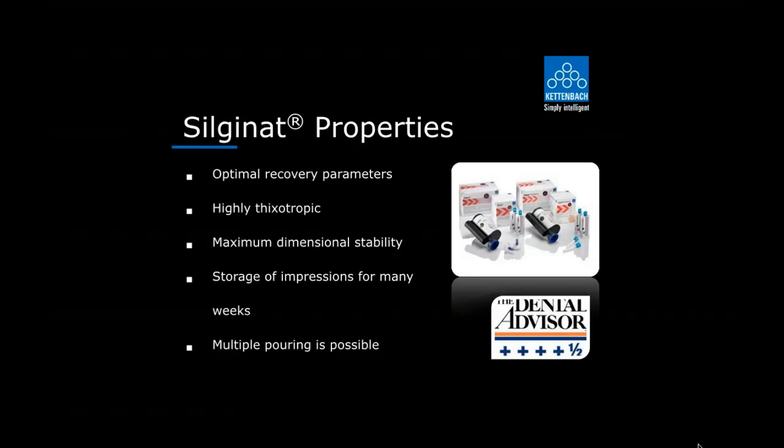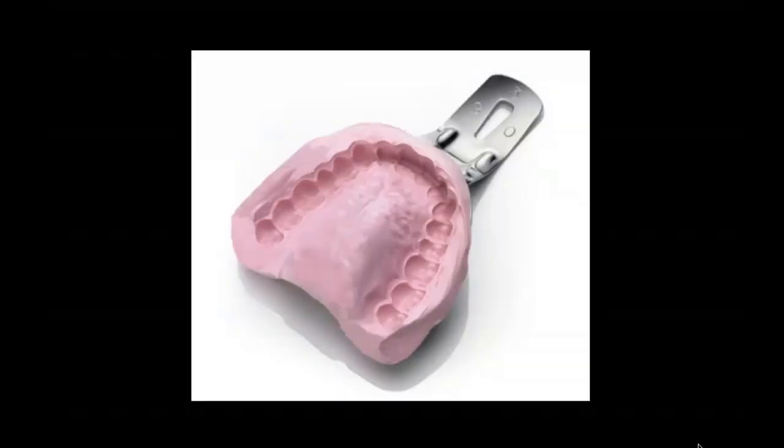You can keep these impressions. Once I get my impressions back from the lab, a lot of times I want to keep the models and the impression for a long period of time. So this is what a typical Silginate impression material looks like.